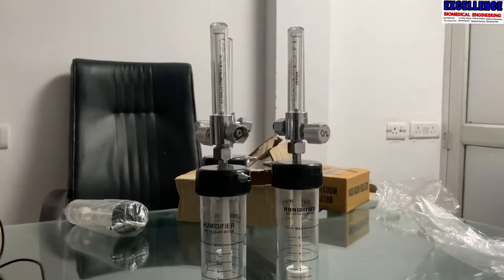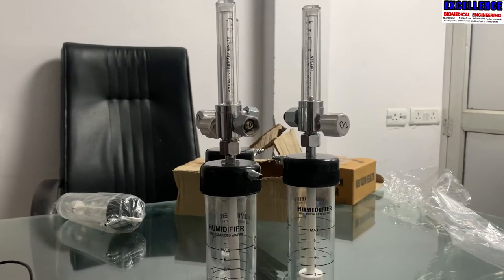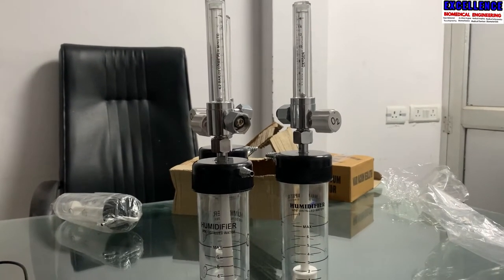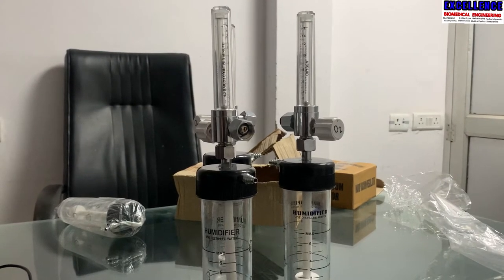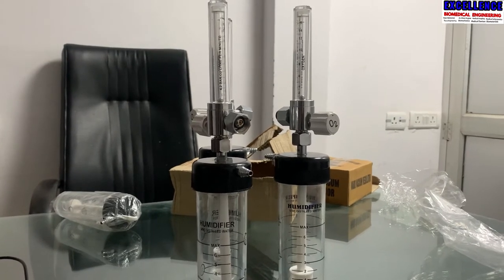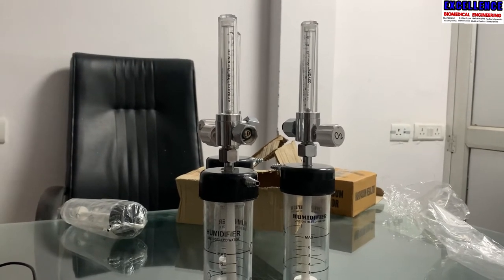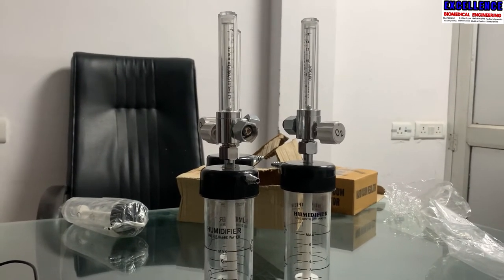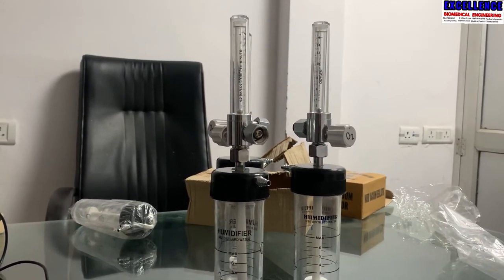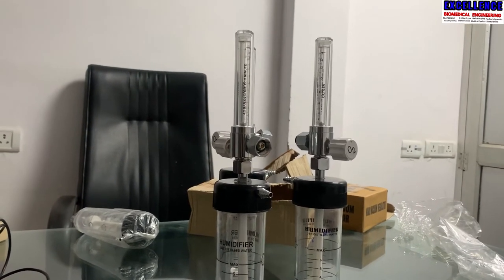A humidifier bottle is a medical device used to humidify oxygen and also to increase humidity or moisture and decrease dryness of supplemented oxygen during therapy and emergencies with oxygen supplying systems like the MGPS — medical gas supply and medical gas pipeline system. Commonly it is known as an oxygen humidifier or oxygen jar.